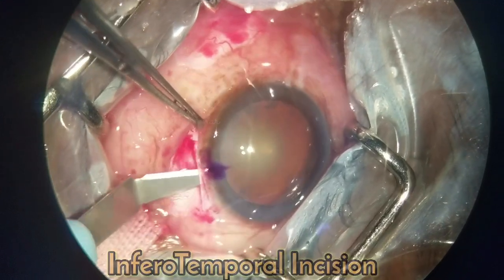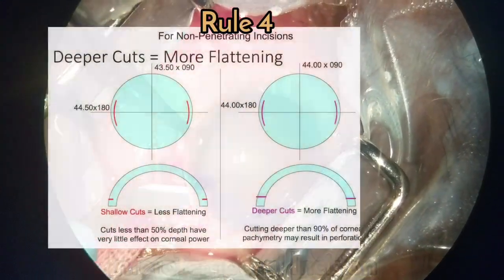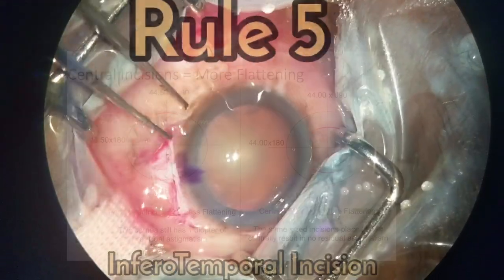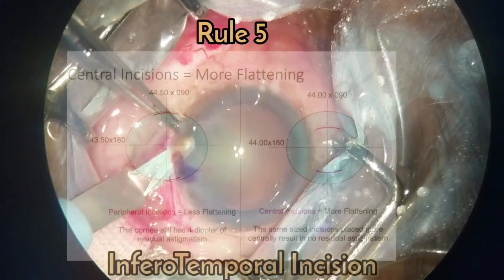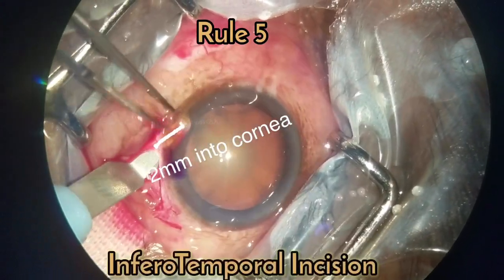Rule number four: the cornea should be entered more centrally and into deeper layers to flatten it more.